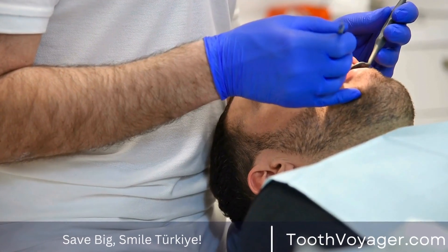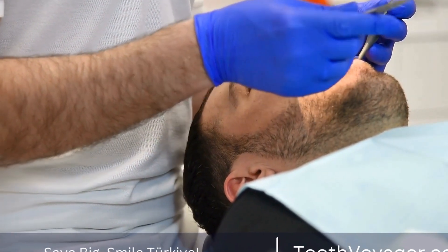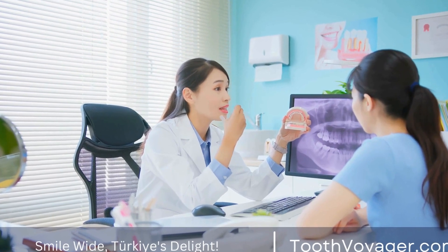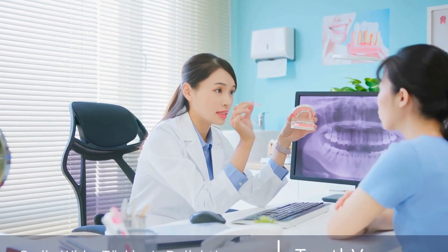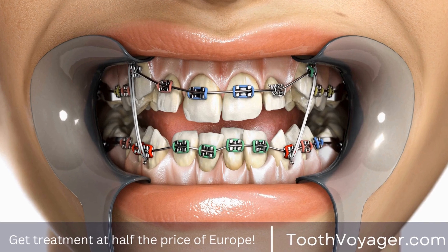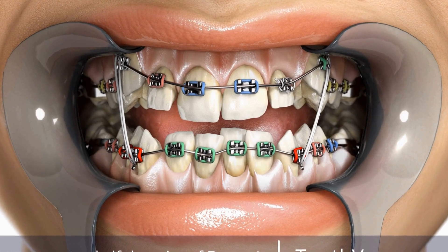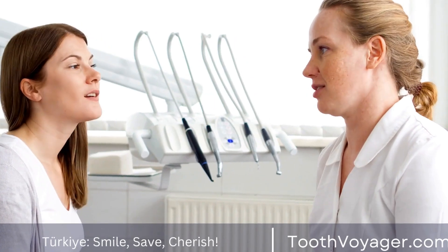Denture creation is an intricate procedure that requires creating custom prosthetics to ensure maximum comfort. Working closely with a highly skilled dental technician, patients are able to make sure that their prosthetics fit comfortably and work correctly. Dentures that are custom made not only restore the function of your mouth but also enhance the appearance of the patient's smile and can boost confidence.